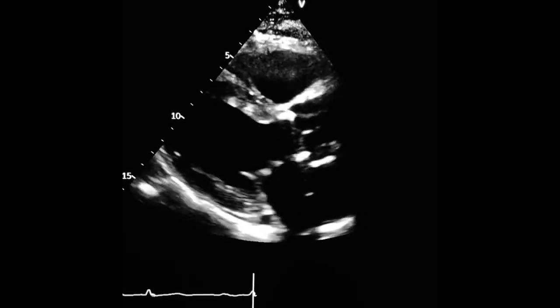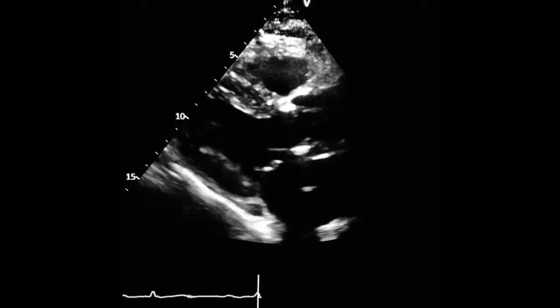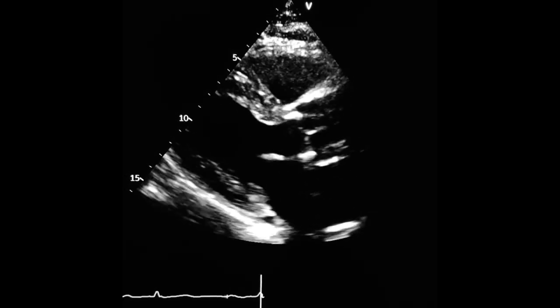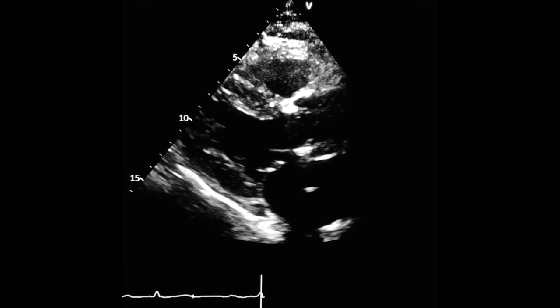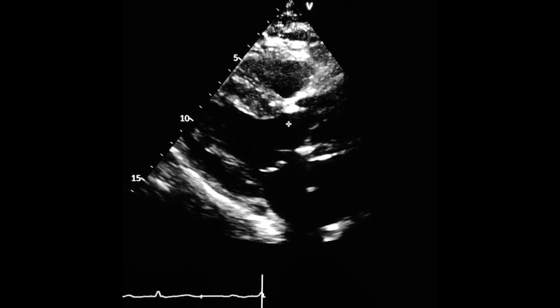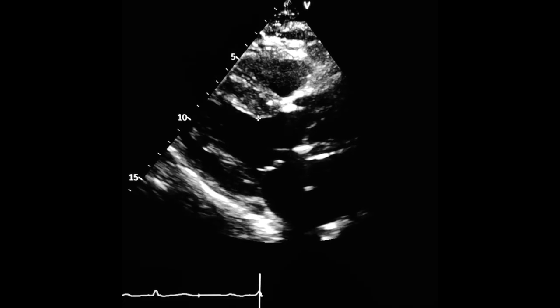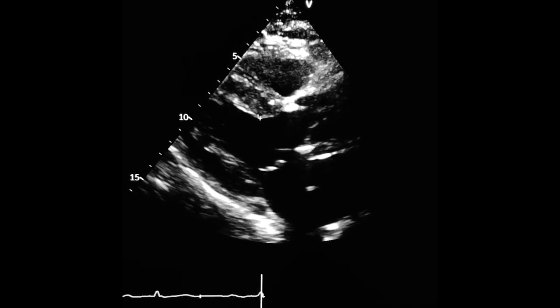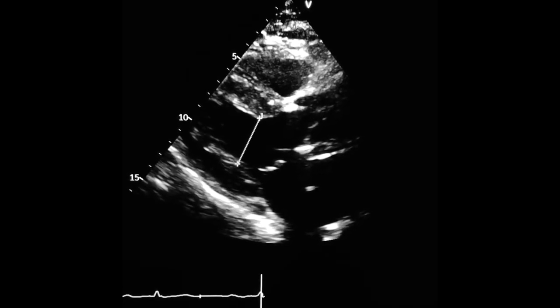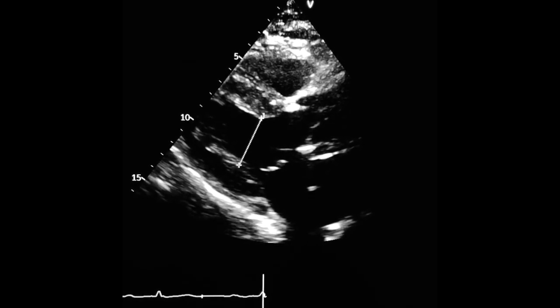Now, to measure the systolic diameter, we are going to freeze the image at the end of systole. And we are ready to measure the systolic diameter from the septal endocardial border to the posterior wall endocardial border at the base of the heart.